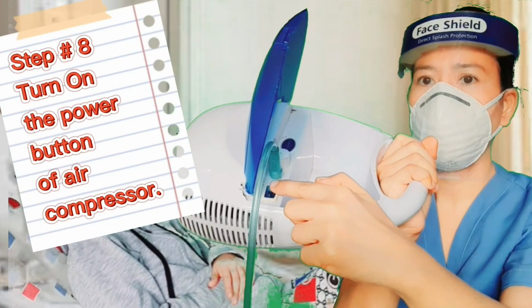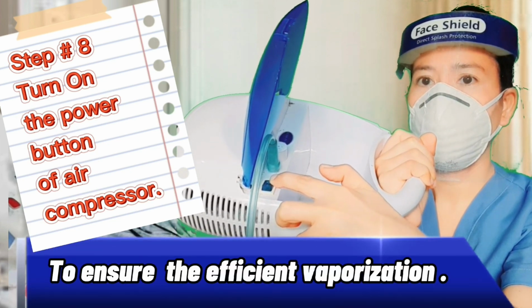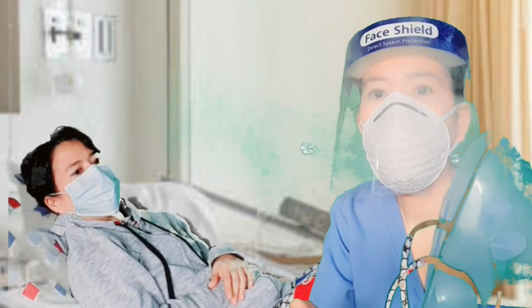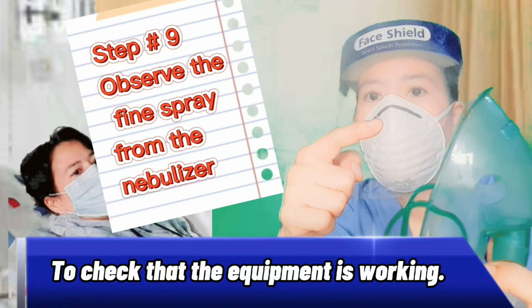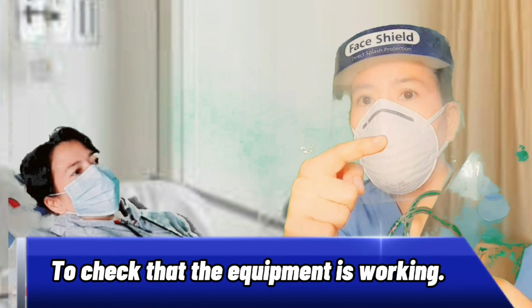Step number 8. Turn on the power button of air compressor to ensure the efficient vaporization of medication to be given. Step number 9. Be sure to observe the fine spray from the nebulizer. It's a good way to check if the equipment is really working.